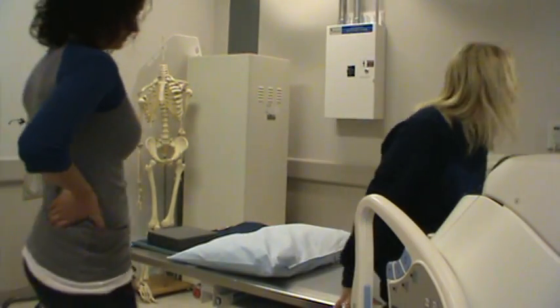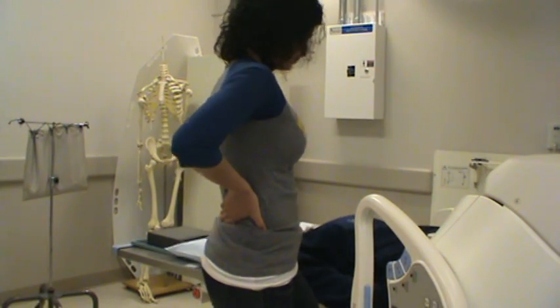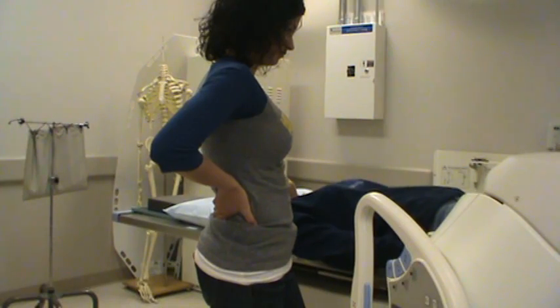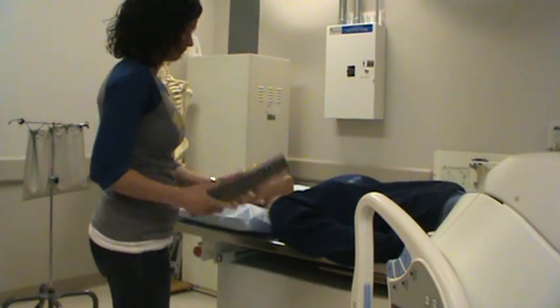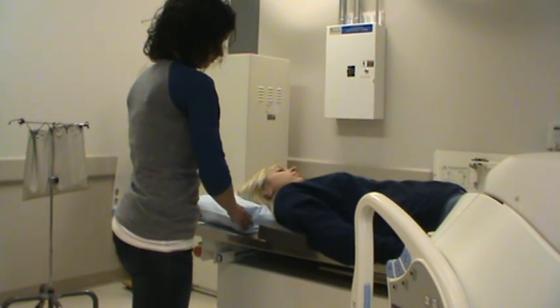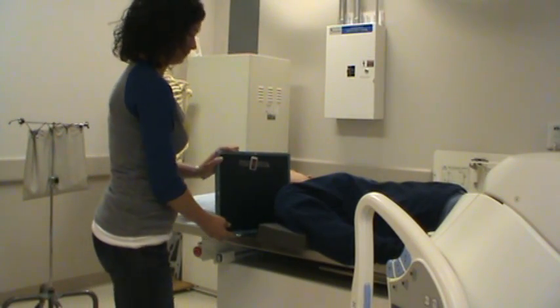Place the patient supine to the front edge of the table. Raise up the table. Place support under the shoulder to center the part in the central line of the IR. Have the patient turn their head away from the IR.